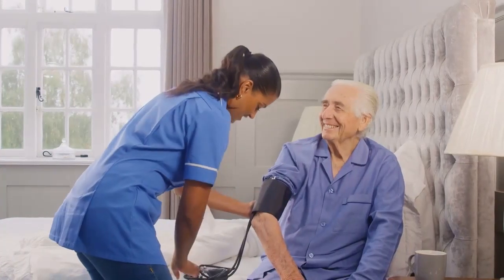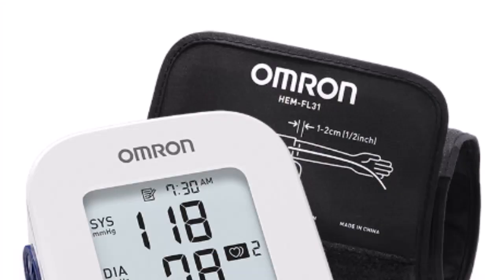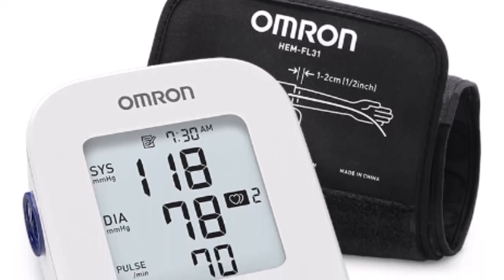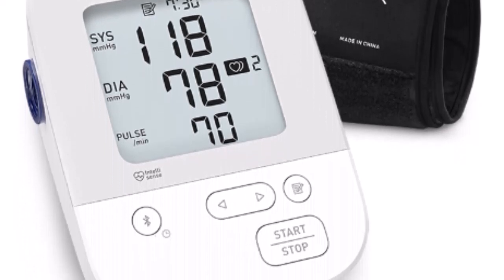In conclusion, if you want to make monitoring your blood pressure fun, easy, and accurate, then try the Omron Silver Blood Pressure Monitor. It's the perfect choice for you. So don't wait — go out and buy one today and start feeling confident about your health and wellness.